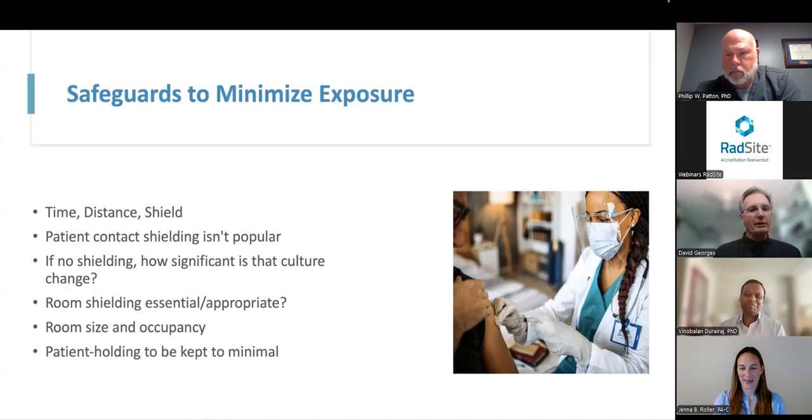Sure. Yes, absolutely. As I mentioned earlier, we do build this machine with internal shielding. It is a fully shielded machine. As it applies to the shielding of the room itself, we have often counseled our customers who are taking in machines to communicate with their medical physicist of record so that they can determine if local authorities require shielding, regardless of the device that is going in. That's not within our bailiwick. Ours was about protecting the patient and making sure the safety of the operator was taken into consideration. But the room, we leave to the state and to the facility's medical physicist to determine if they need to add shielding, if it does not already exist. Much of our product will go into existing rooms that probably have legacy shielding in them from previous pieces of equipment that were in the room.